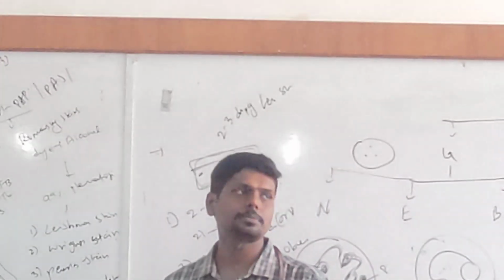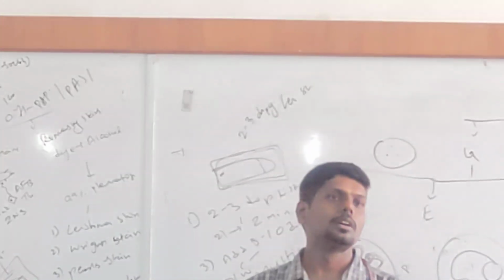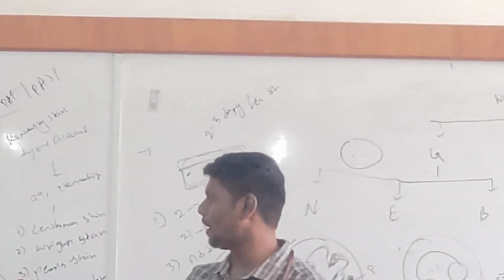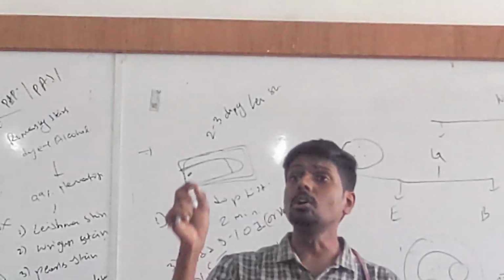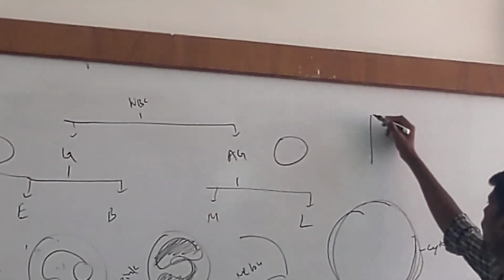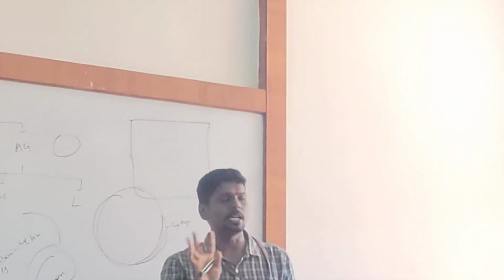Once you have identified your white blood cell field, now you will add a drop of cedarwood oil, and you will add a cover slip, and you will observe on the 100x. You will start counting white blood cells. How to count the white blood cells? Now listen, very important. You will draw a box. You need not count all the 11,000 cells. Just count 100 cells, that's it.